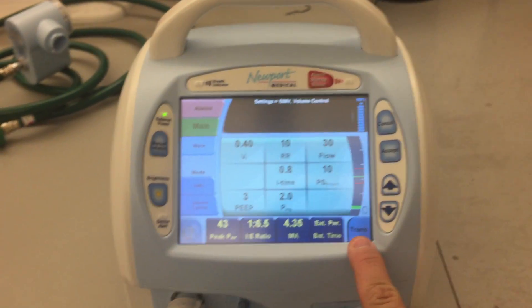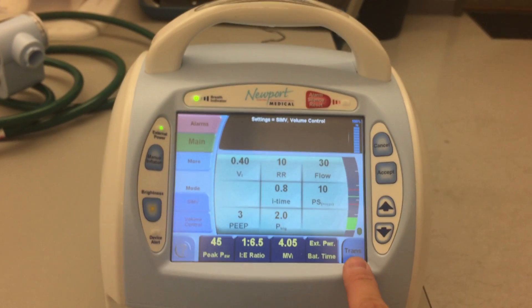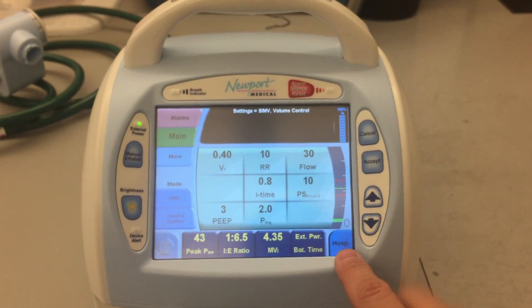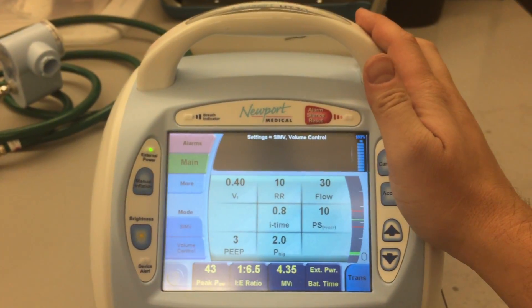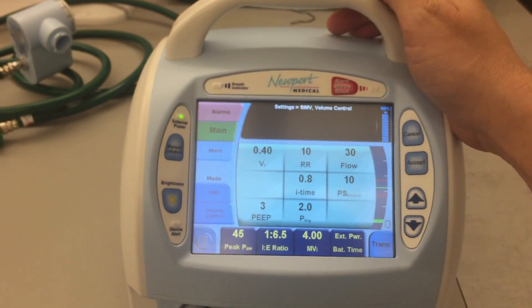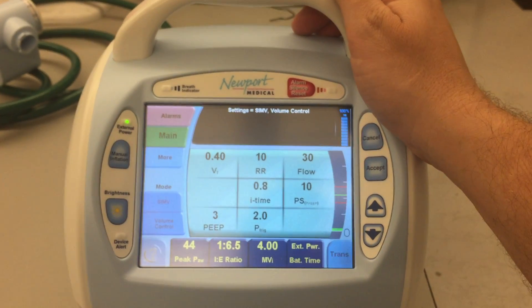This option here tells you what mode you're operating in — it says Transport right now. You could also just hit Hospital or Basic. The big difference is that Transport mode allows you to calculate how much time you have on your oxygen, your high-pressure oxygen source.